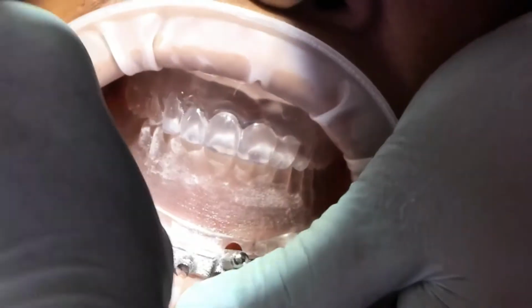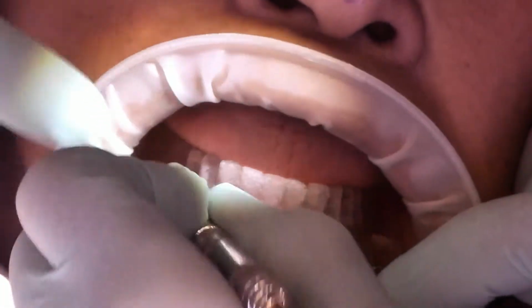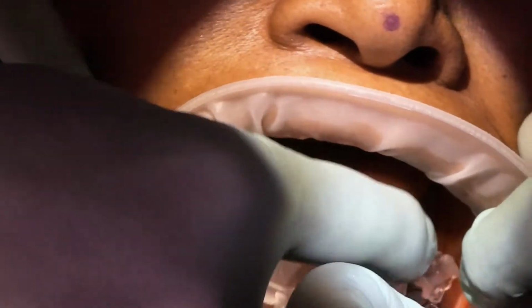You'll notice in this video that Dr. Towell, who's performing the surgery, lays a labial flap. This aids in simplified suturing later, as the bone reduction will allow the labial flap to be folded over the ridge.